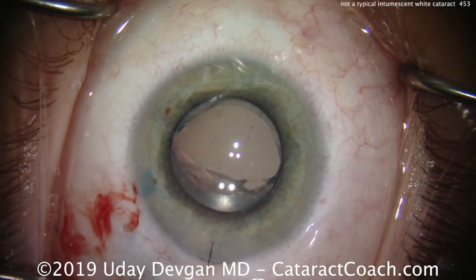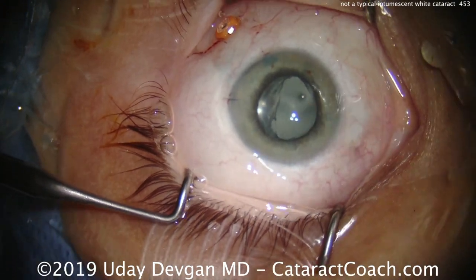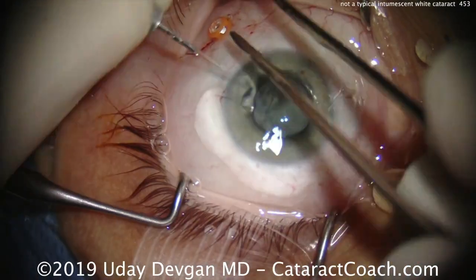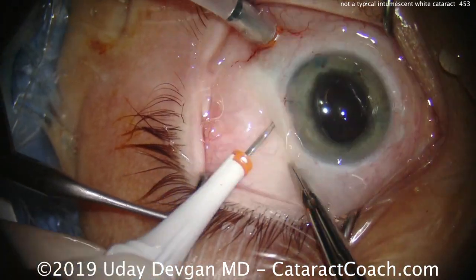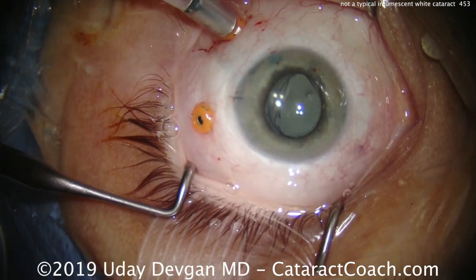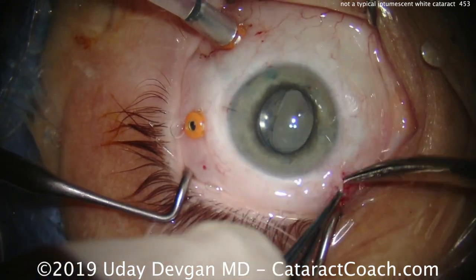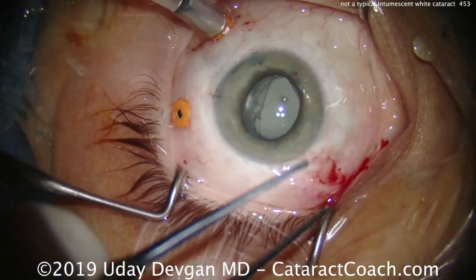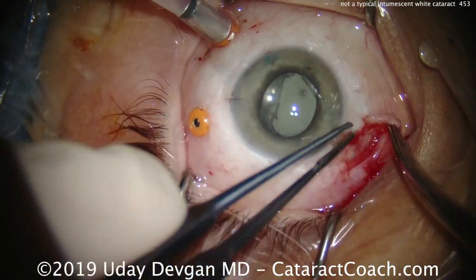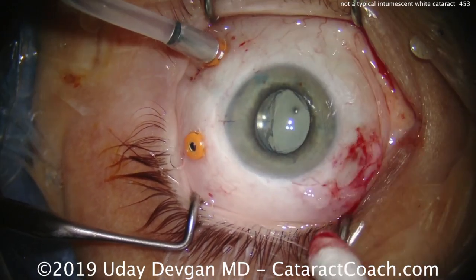And then for the retinal part, we're gonna fast forward through that as well. But the usual small gauge vitrectomy, the lens material on this patient is relatively soft. It's not a very dense cataract. You can tell by the eyelashes here, this is a relatively young patient. This is not a very elderly patient. The cataract was primarily due to the vitrectomy and not from age-related nuclear sclerosis.